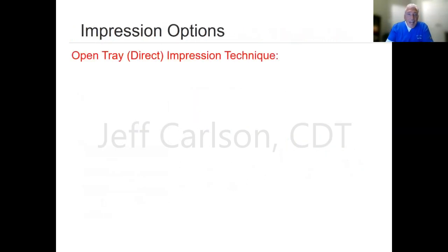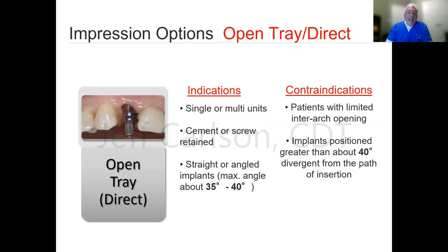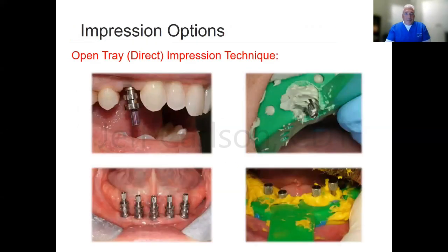All right, so let's look now at direct. The reason they call this the open tray, the direct technique, is when you take the impression, here you'll see it, the impression coping, here's a tall screw sticking up, right? Now you put the impression material, syringe around the coping itself, fill up the tray. You have a hole cut out in the tray, hence open tray. And then before the material sets up, you have to expose that. The material sets up, you unscrew that screw, which is actually engaging the internal threads of the implant. Now it's disengaged. Now when you pull that impression out, the body of this impression post, see all these undercuts here? That is locked into the impression, hence the word direct. The impression coping is directly into the impression.